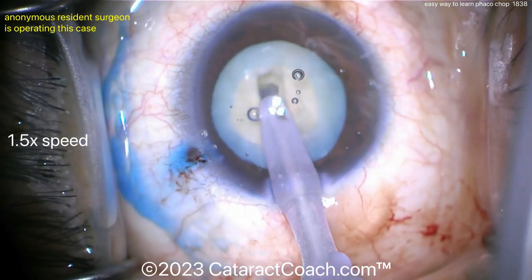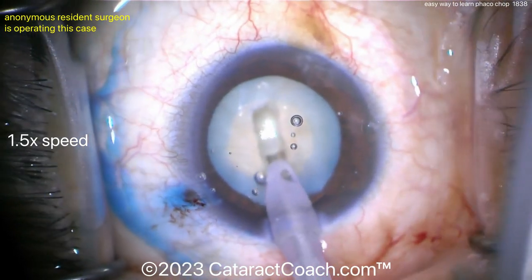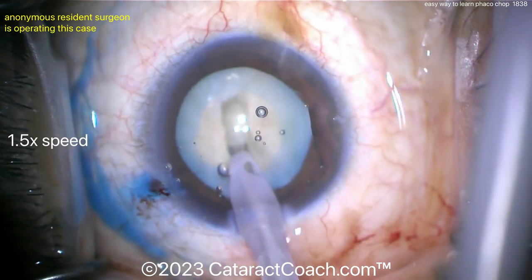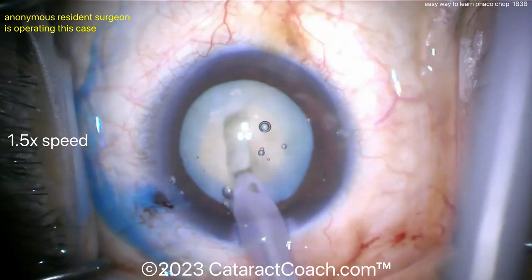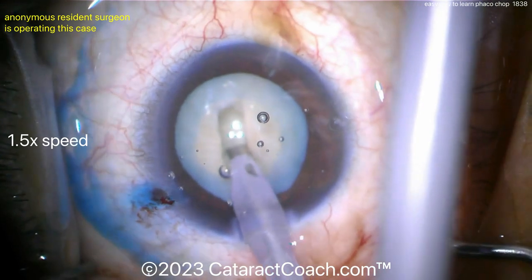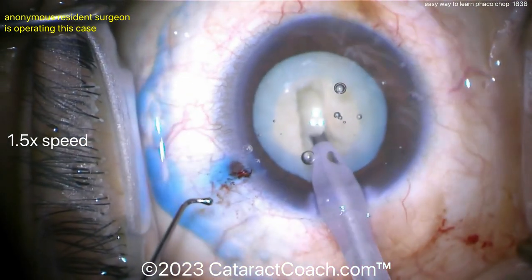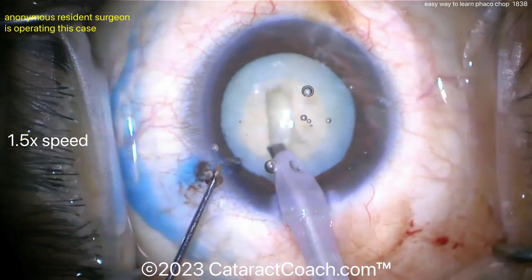If you're a divide and conquer surgeon, at first there's nothing wrong with that — enjoy what you enjoy. But if you want to learn phaco chop, and I think you should learn chop, an easy way is to just start here with your divide and conquer. Get your phaco tubing out of your view.